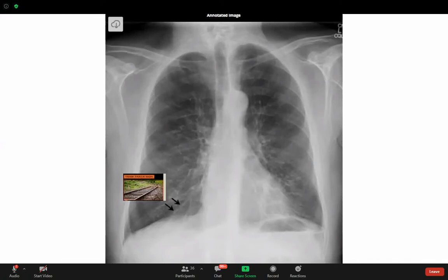If you would like my advice, take at least the abnormalities, for example pneumothorax, and go over all the textbooks and X-rays you have, even just type it in Google or any trusted resources you have, and see variations of that pneumothorax. So you can get your eyes trained to discover pneumothorax. The same with pneumonia. The same with tram track.